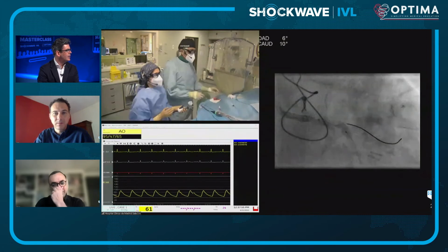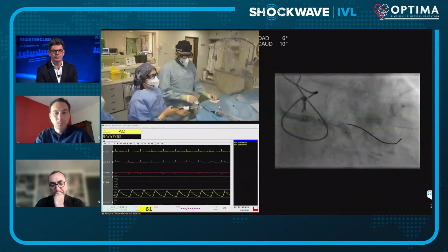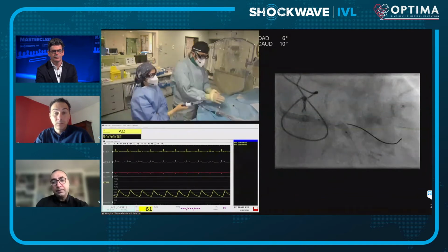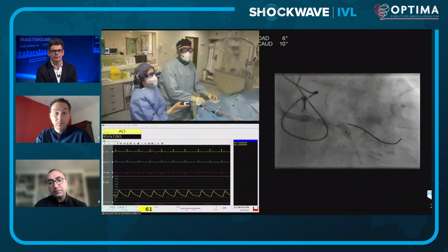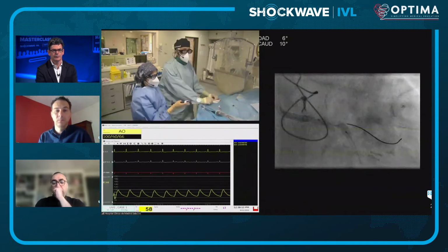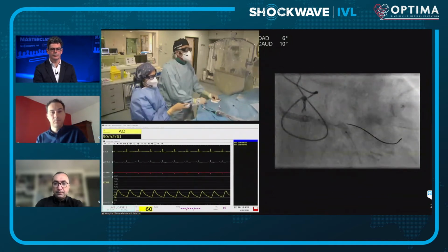They are sensed. There are a few reports showing captures, that occasionally this may lead to interaction with cardiac rhythm, but this is really exceptional. We never had any case. But it's good to mention it because then the colleagues know about this. It's something that they may see a reflection in the EKG of an electric phenomenon that is taking place in the heart, which is the generation of these spikes.